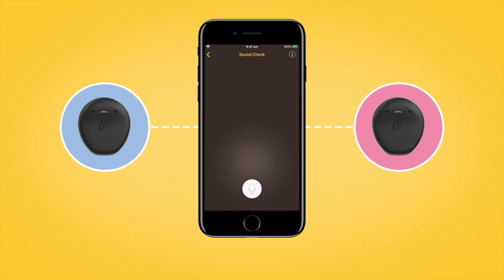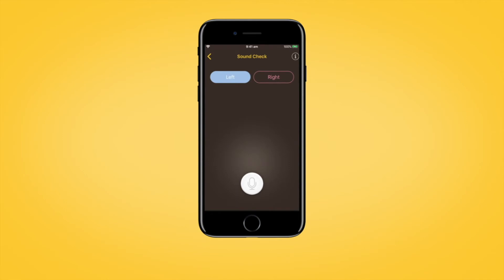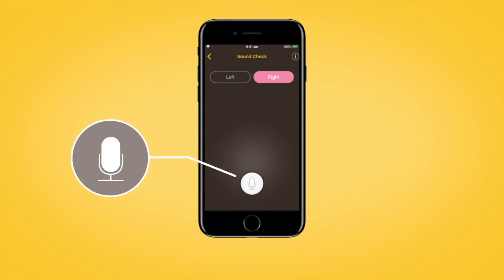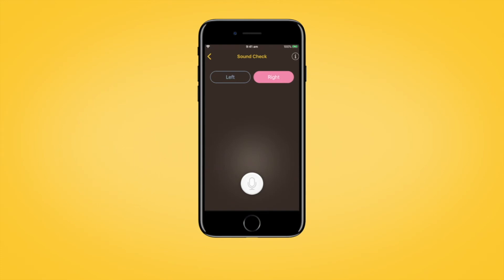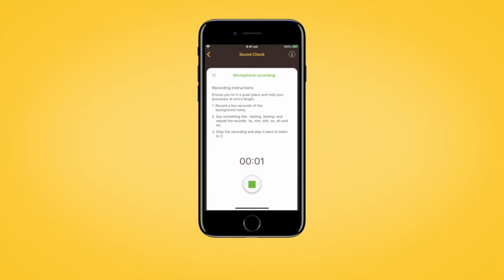If you have two sound processors, the left one will be selected when you open Sound Check. If you want to select the right sound processor, tap the Right Processor Select button. Then, when you have selected the sound processor you want to test, tap the Start Recording button to begin recording sound from your sound processor microphones.